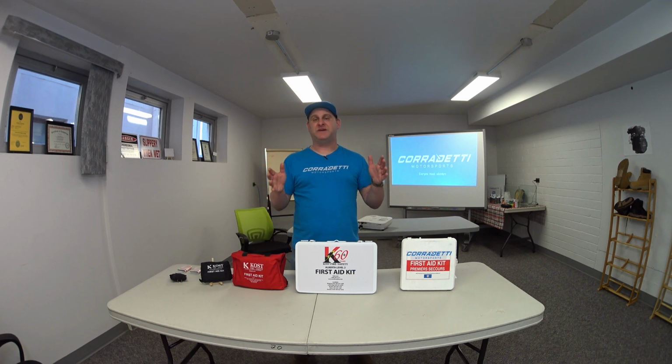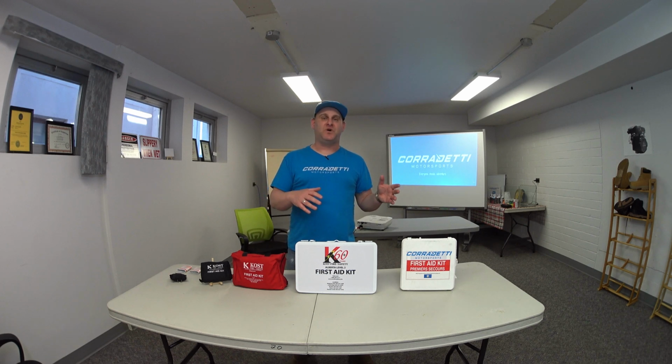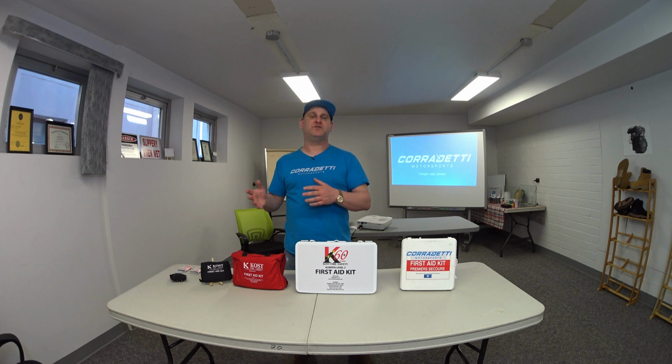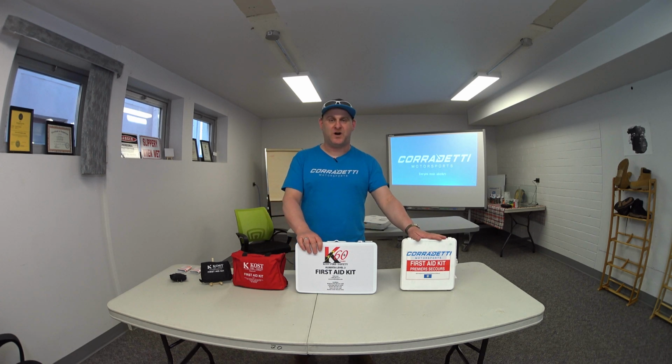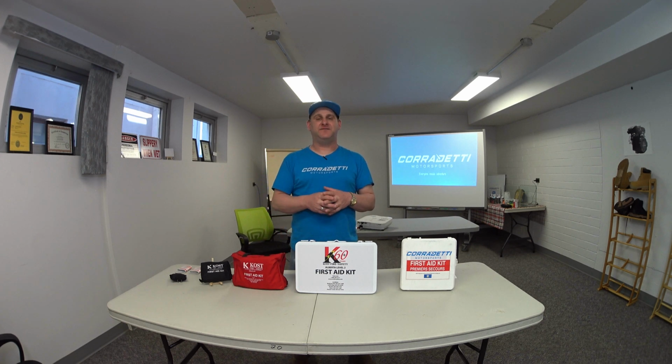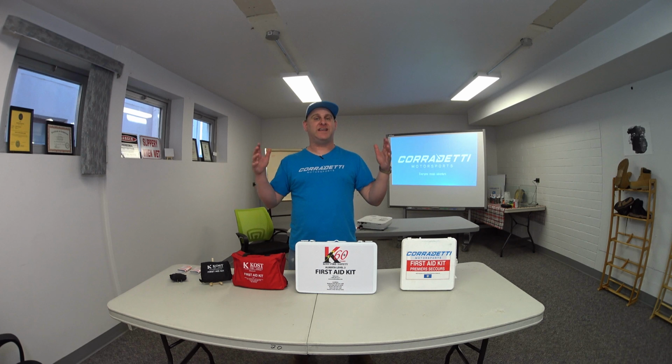The OH&S regulations basically have to do with your training, your kit, and your risk assessment. Those three things put together will dictate what type of kit you are required by law to have at the Alberta workplace. We are going to talk a little bit about personal first aid kits, how to actually build one to put in your vehicle, your home, and if you're out enjoying the wonderful, beautiful nature that surrounds us in Alberta. We're also going to take a look at which case is the best, which one's the most water resistant, which one has the most ease of use when it comes to carrying it. So again, there's a wide range of choices to look at. There is no silver bullet of one case does it all.